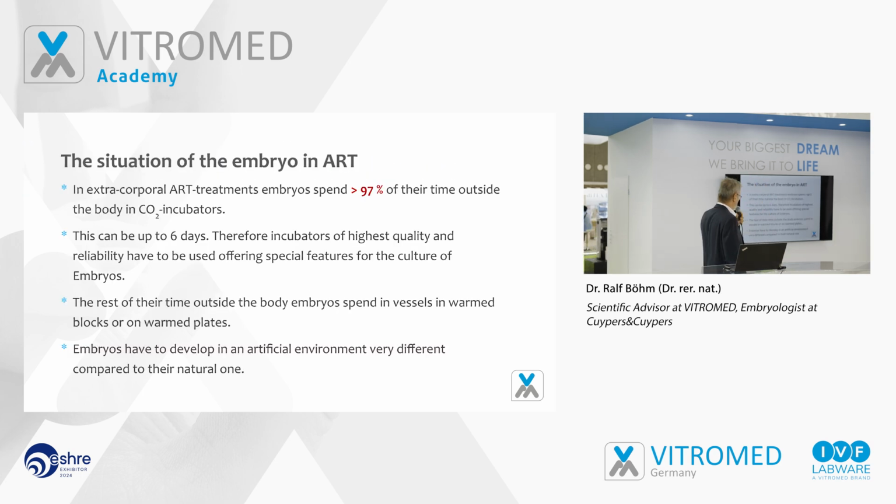And what you also should always keep in your mind is the situation of the embryo. Why do I say that? Every time you do a medium change, the embryos have some stress because they are out of the incubator. So you should always think about that. In what we do, in 97% of the time, the embryo is outside the body. It spends it in a CO2 incubator. And this is, of course, a very artificial situation. And this can be up to 6 days.